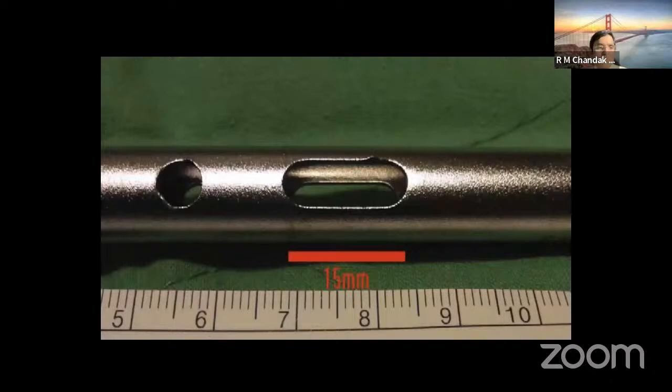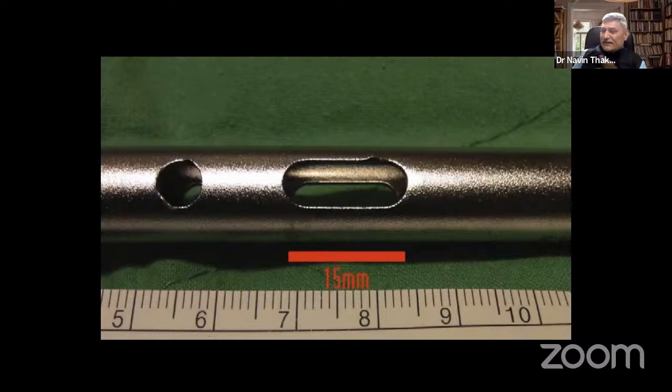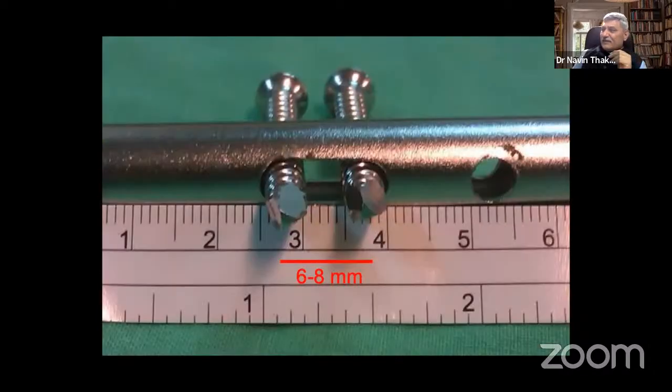How much dynamization is possible? 15 mm is the total. So we can do this much dynamization, not more than that. We have to subtract the screw diameter. So 6 to 8 mm is the gap where we can do dynamization, not more than that.